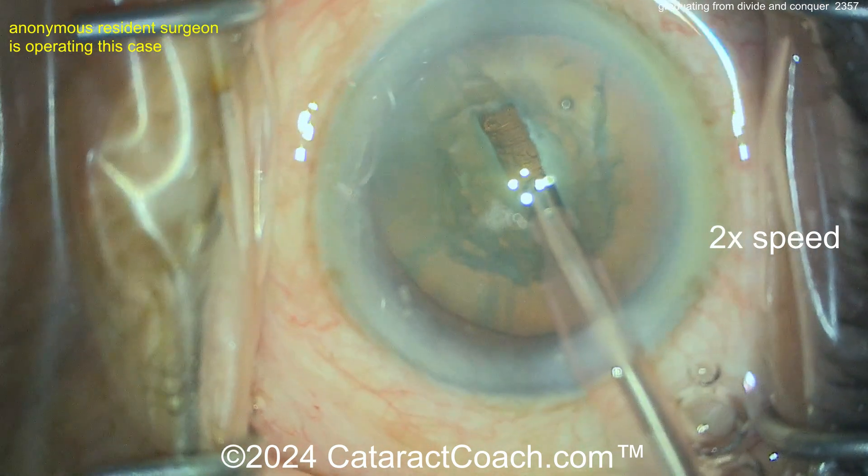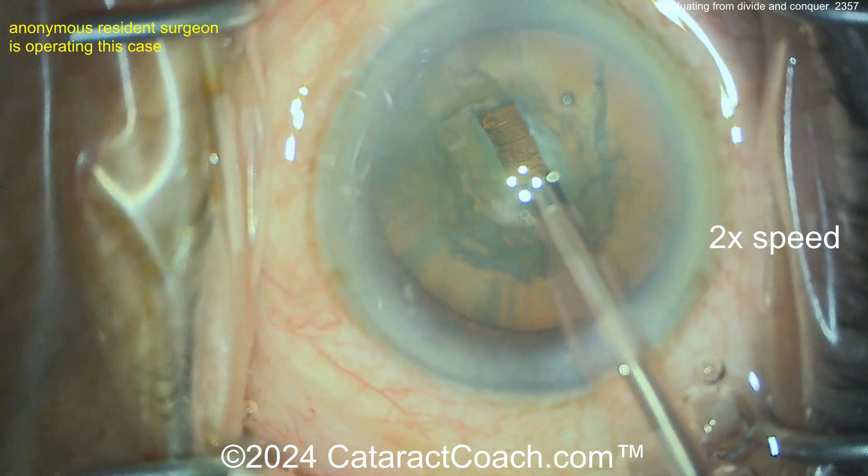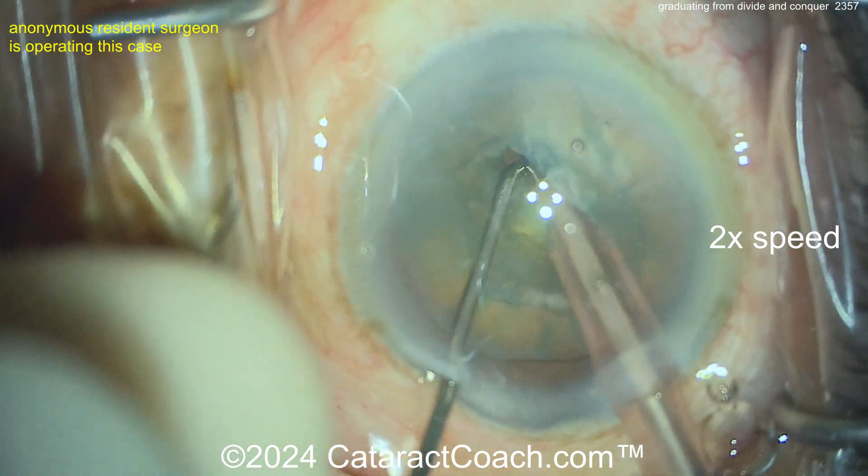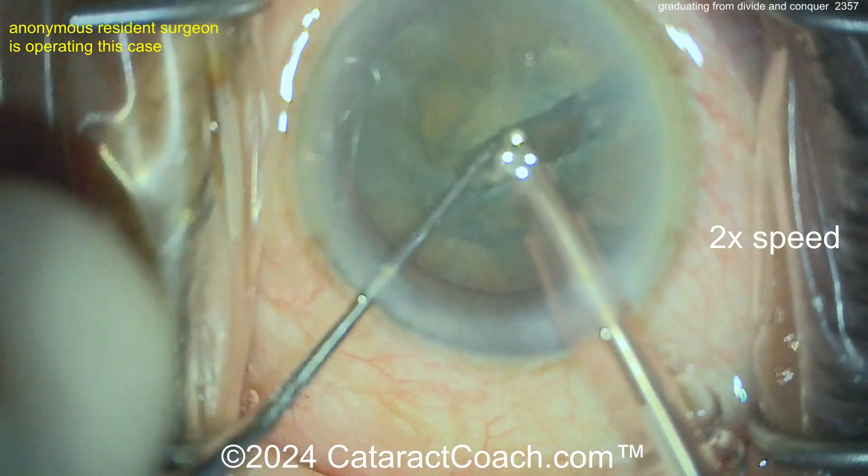Get the probe a little bit deeper. Right now you can see the sleeve hitting the side of it. So if you widen up the groove a little bit, or you can just crack it — let's see you crack it right here and propagate that through. Beautifully done.